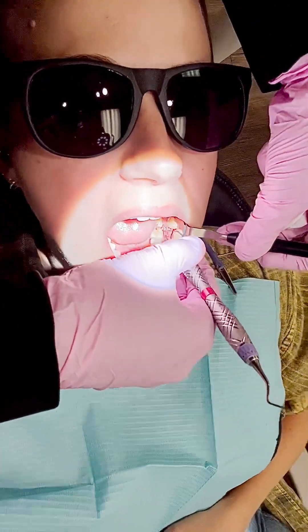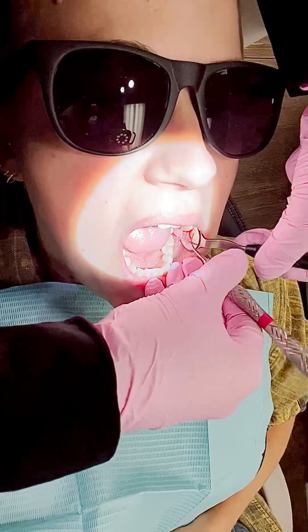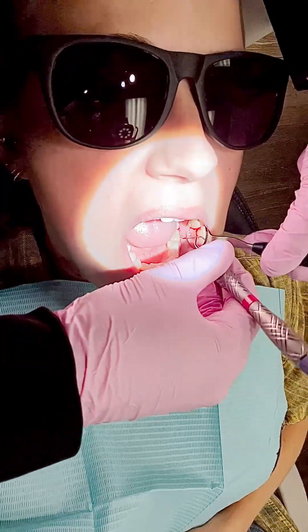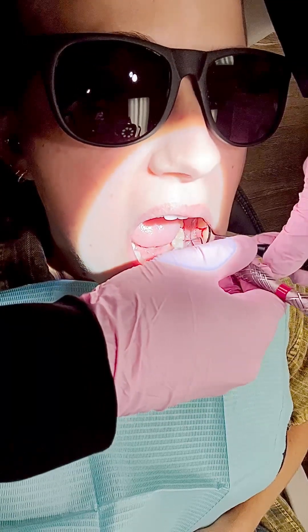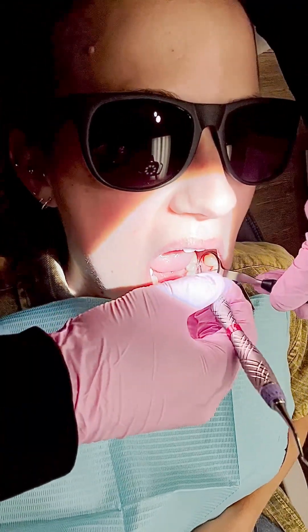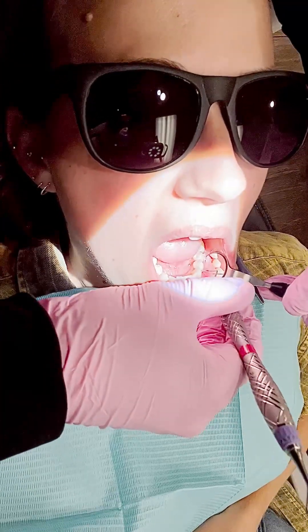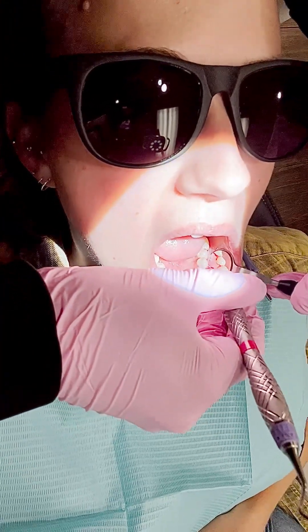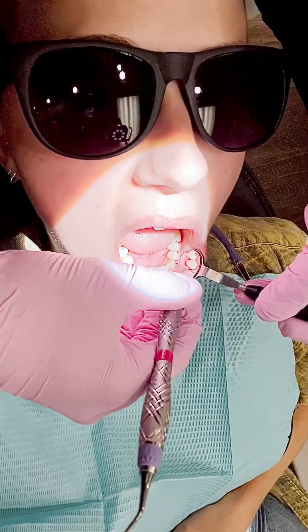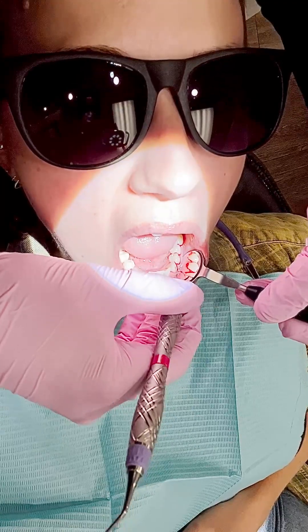I'm retracting with my mirror — not super hard, just keeping light pressure. I'm fulcruming on her lip, chin, and teeth. I do a lot of backhand fulcruming, so the nail bed of my fingers is usually my fulcrum. Now I'm coming in, getting up into the contact. As I roll into the contact, I actually put my instrument down and kind of flat against the contact — that's how you get up into that contact area.